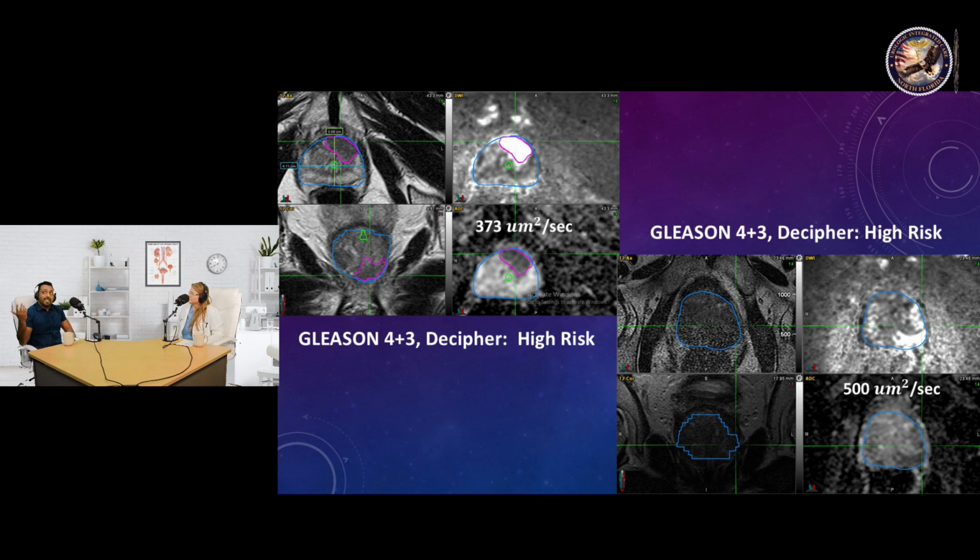Light, for example, has its own frequency and wavelength, its own magnetic field, everything. The magnetic fields used in MRIs operate in the same frequency range as AM/FM radio, and there's a lot of AM/FM radio just around us. So generally, for MRI we have to build these cages, these rooms that can block out all signal outside of the room.